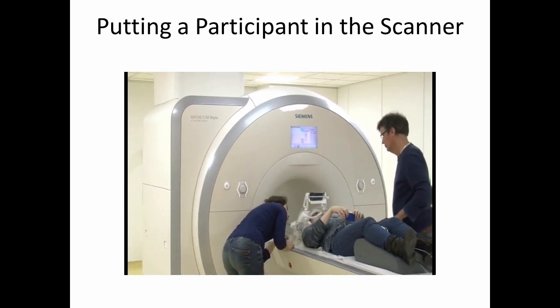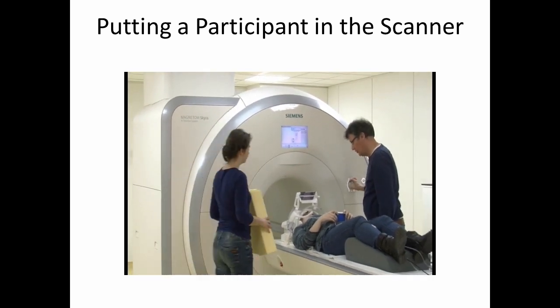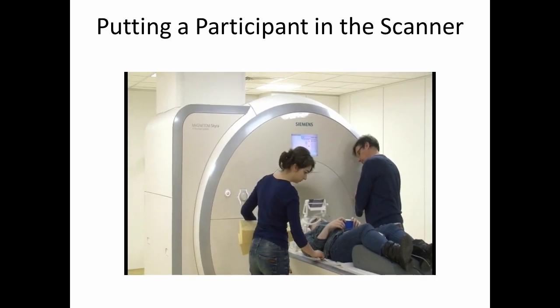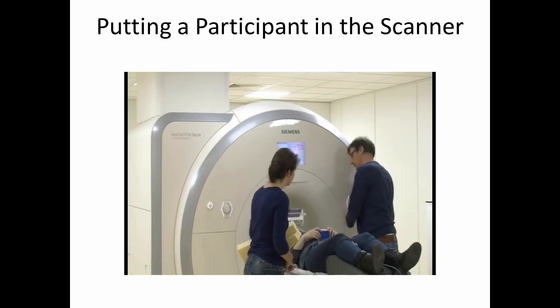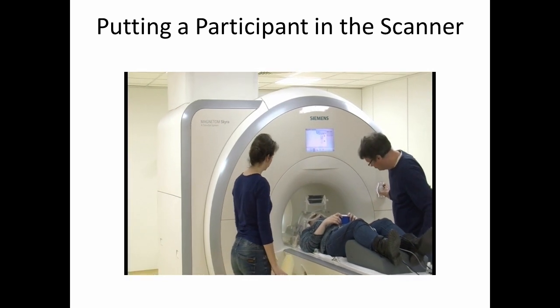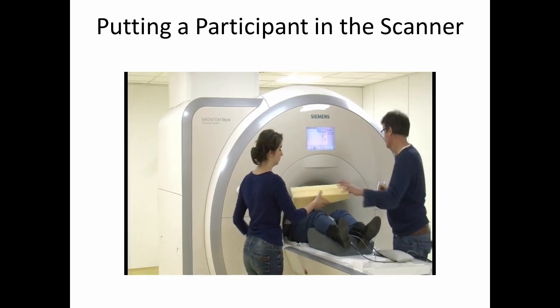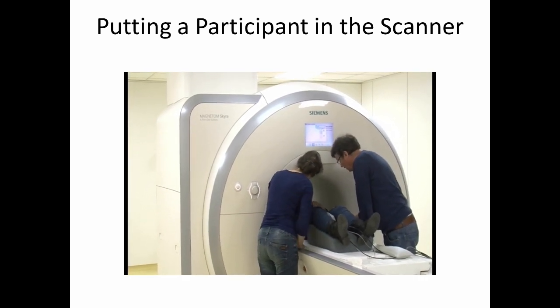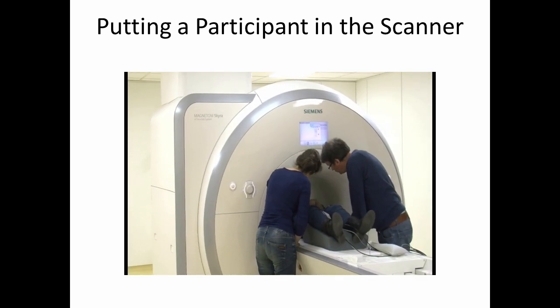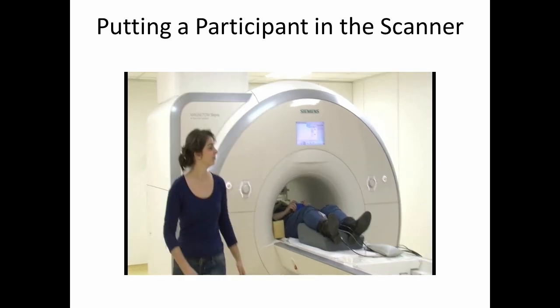The participant is asking about the button box. The technician is making sure that the participant has an emergency squeeze ball that they can squeeze in case they want to get out of the scanner. They then line up the participant by putting a marker right by the person's nose, and finally, they're going to actually put them inside the magnet. The last step is to put a couple of pads underneath the participant's arms. Again, this is to make sure that the participant stays comfortable, as they'll be lying there for about an hour and a half, and it also makes sure that they know where they are in the scanner so that they don't move too much.